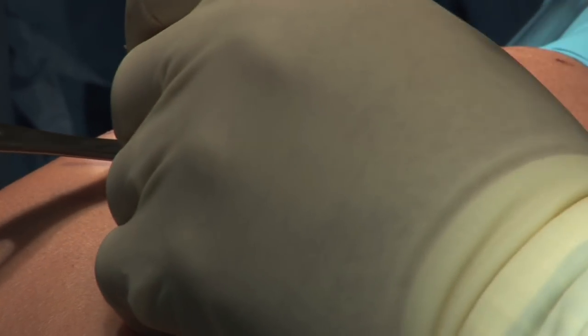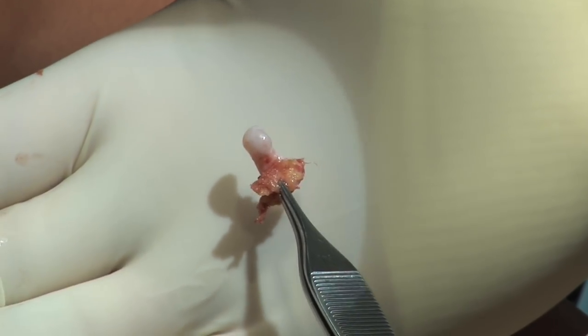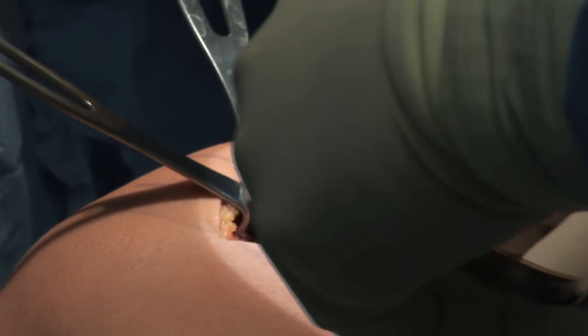An osteotome is used to remove the osteochondroma flush with the medial cortex of the femur. This is the specimen. A rongeur is used to smooth down the edges of the bone to prevent stress riser.